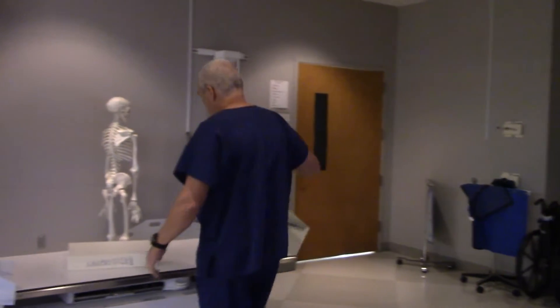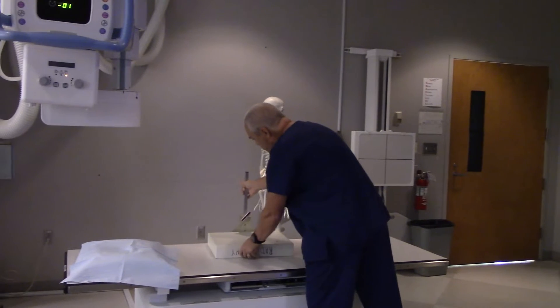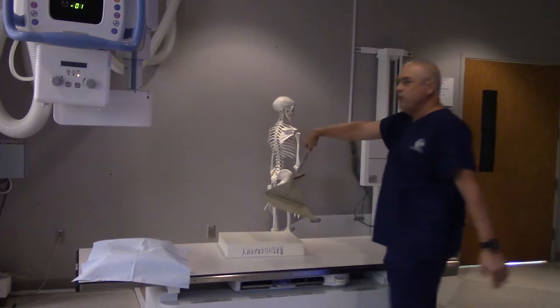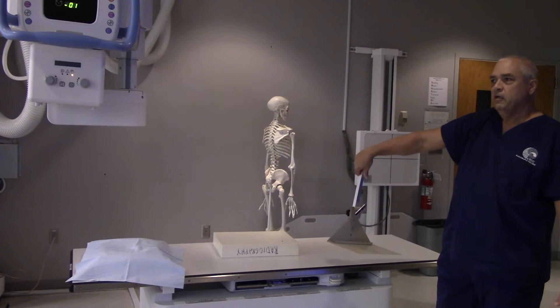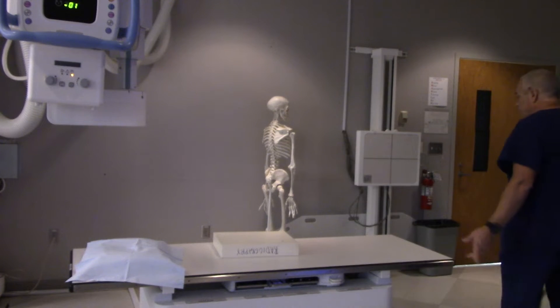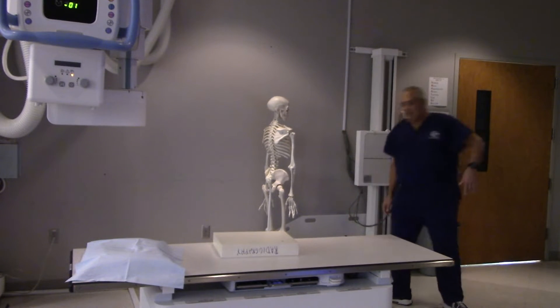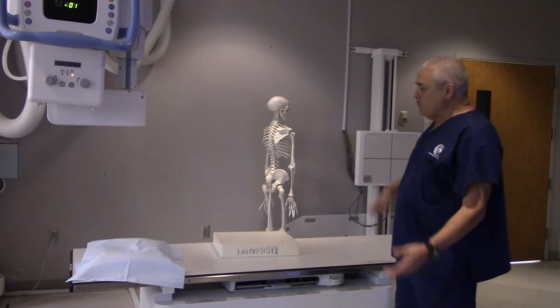So in order to do the decubitus abdomen x-ray, I typically would not put this equipment here before I get my patient in place. How come? They might knock it over, exactly. Not that we would know anything about that — that's the kind of thing that happens to other people.